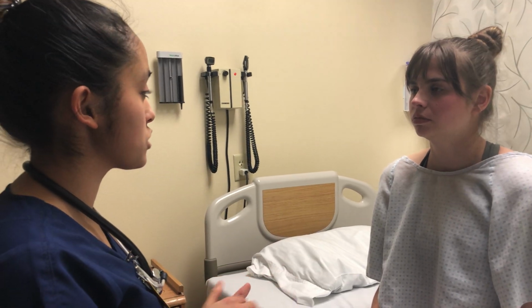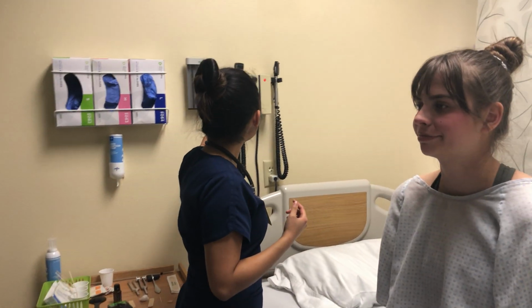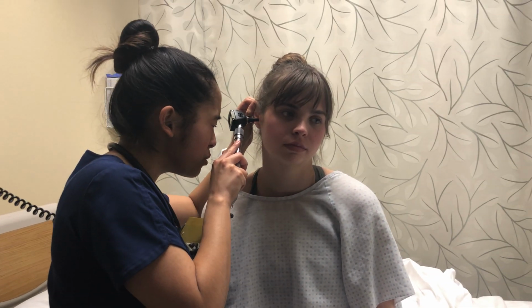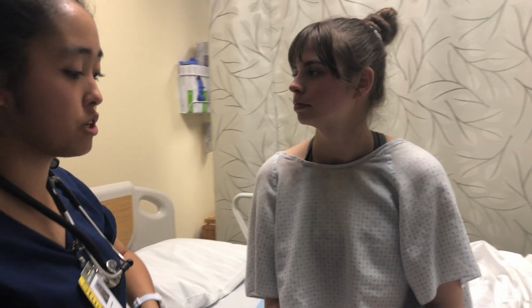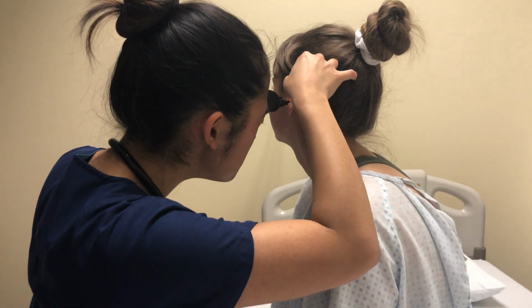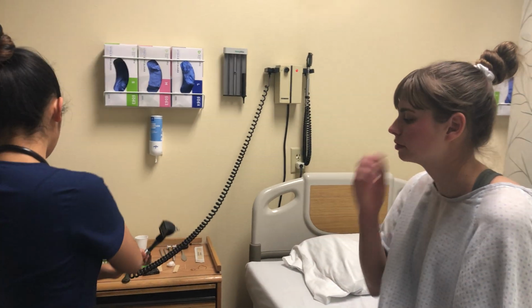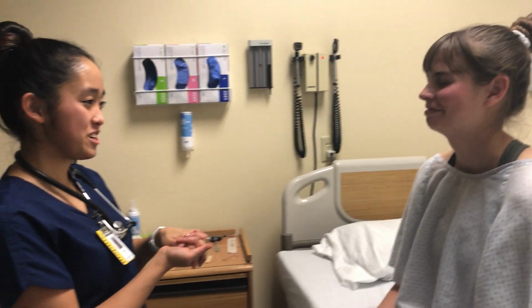I already palpated the external structure, so I'm just going to go ahead and take a look inside your ears. And I'm looking to see that your tympanic membrane is intact and pearly gray. Up and back. Okay, I see your tympanic membrane. It's very nice and pearly gray, not too much cerumen. This side, pull up and back. Let me know if this hurts you at all. Good pearly gray tympanic membrane, and not too much cerumen on that side either. And there were no perforations.